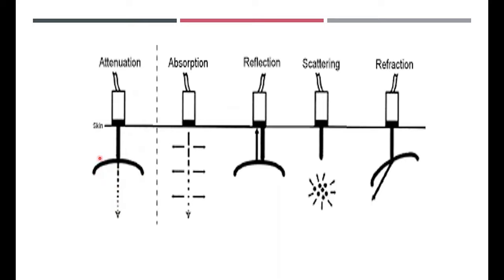A good example of that is A lines. So if that's the skin and this is the pleural margin, when the pleural margin, being superficial, has ultrasound waves hit it, being a flat perpendicular surface, it causes reflection back, and the outermost margin causes a lot of reflection, but you have tissue below the pleural margin, and that tissue absorbs those sound waves. And when you have that, you have what we call reverberations. Now, the A lines, as you see, are parallel lines. And sometimes they get less intense as you go into the lung. That is classically because of the concept of attenuation. Clearly absorption contributes to attenuation, as the tissues around absorb sound wave energy, making the sound wave less strong as it goes in.